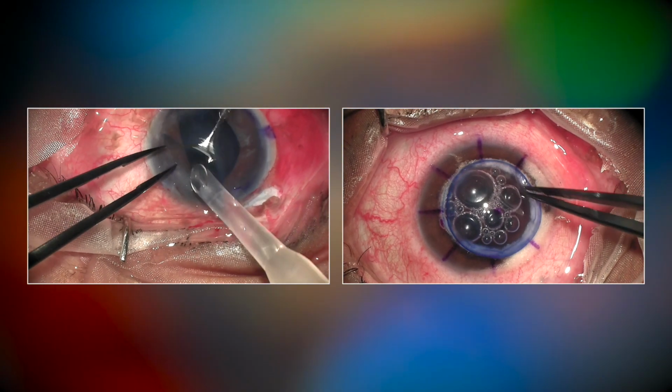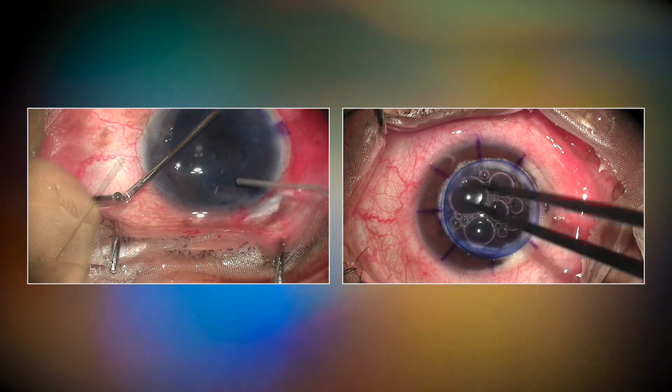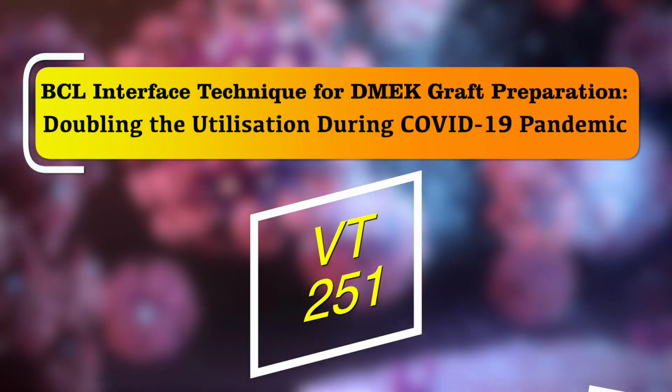So we need to be wiser so that we can double the utilization rate. Most practically, using the same donor tissues for DMEK and DALK. Here we describe a novel BCL interface technique of donor preparation in DMEK so that the anterior part can be used for DALK.